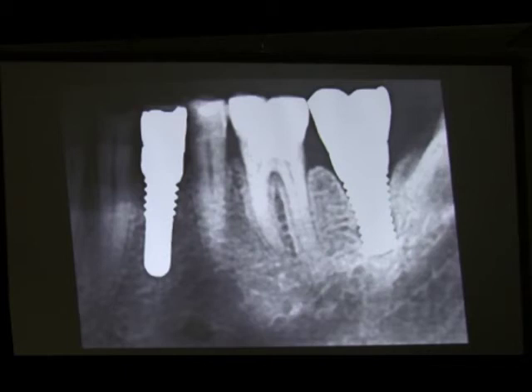Yes. But if they tell me 5 times, doctor, people will not know I have an implant here, right? And they ask me this. I tell them, if it's my way, probably not. If it's your way, meaning if you tell me to put the crown, don't ask me if you have a longer crown on the implant. So when they always follow our protocol and we end up having a longer gum on the implant, it's our fault if we didn't put a temporary crown.